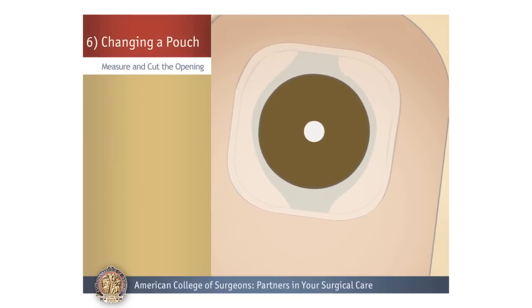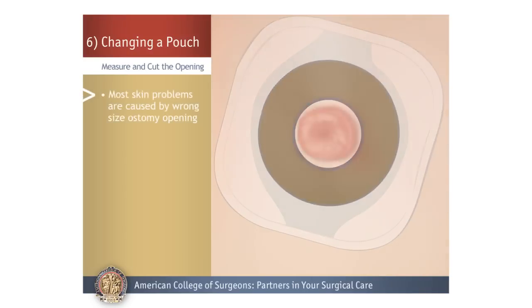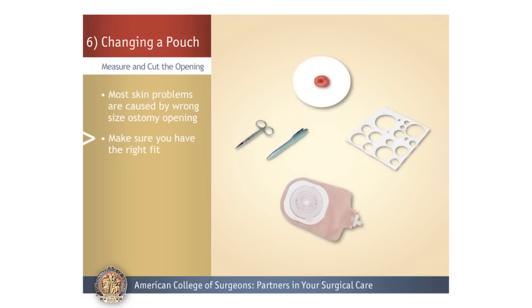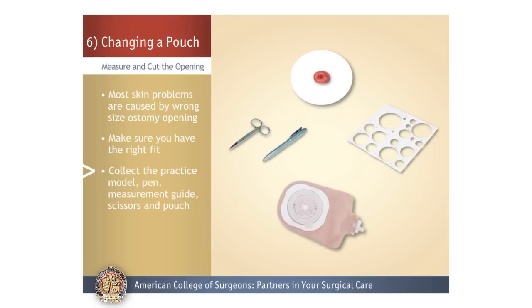Measure and Cut the Opening. Next, measure and cut an opening in the fresh barrier. Most skin problems are caused by the ostomy opening not being cut to the right size, so it is important to measure the stoma and make sure you have the right fit. You will need the stoma practice model, pen, measurement guide, scissors, and pouch from your skills kit.